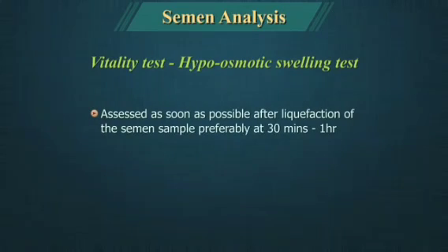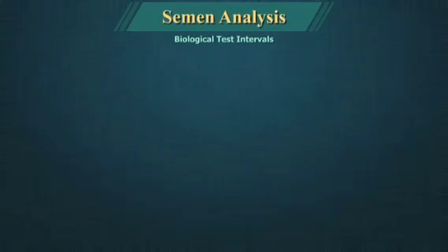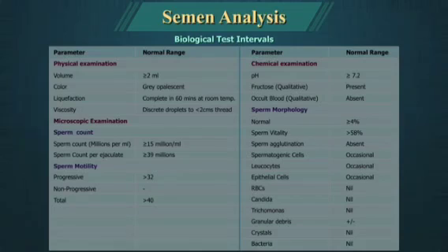Sperm vitality should be assessed as soon as possible after liquefaction of the semen sample, preferably at 30 minutes and latest within 1 hour of ejaculation to prevent deleterious effects of dehydration or changes due to temperature. The biological reference intervals for semen are as follows.